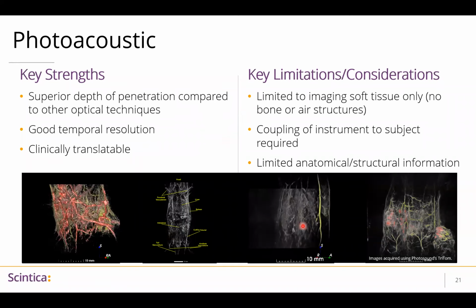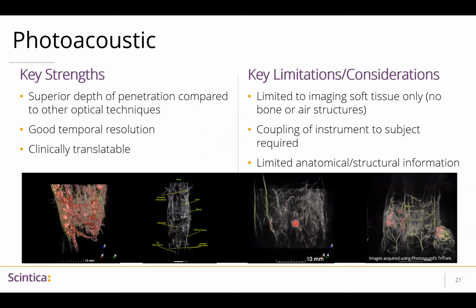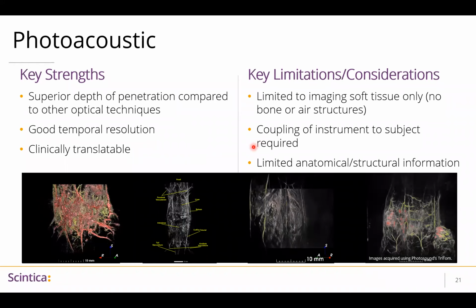But as we can see here, we can make out some of the organs like the kidneys, the spleen, and the main vascular structure to be able to identify where we are looking within the different regions of the body.